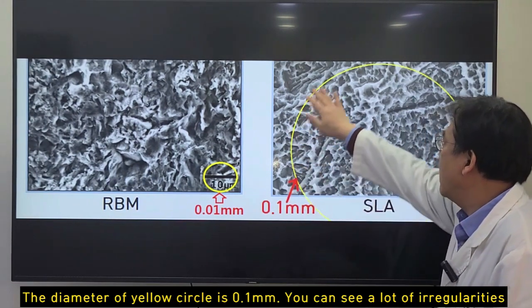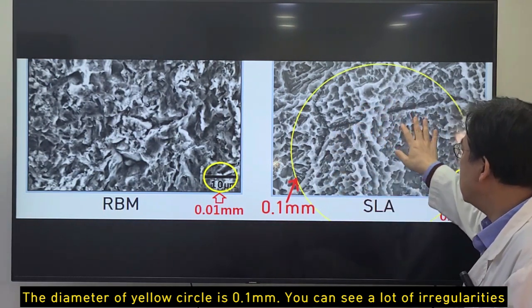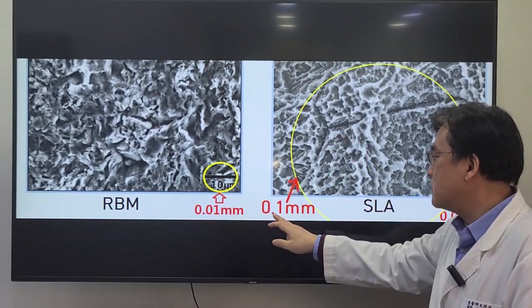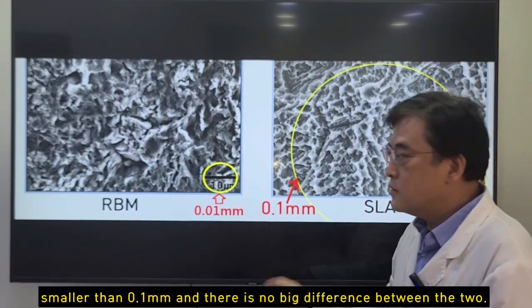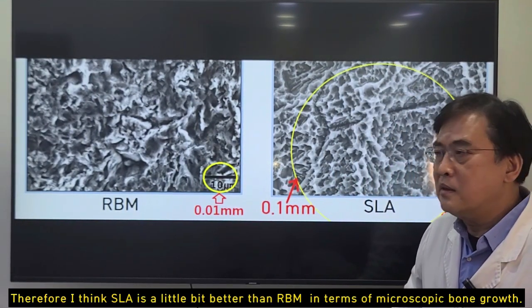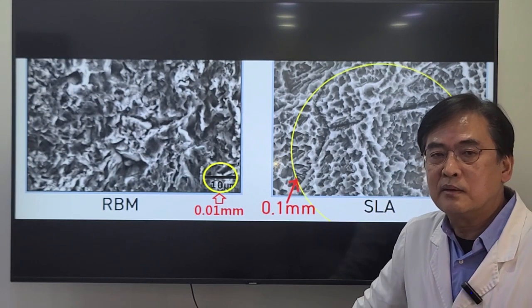The diameter of the yellow circle is 0.1 mm. You can see a lot of irregularities coming into the circle, which means the size of the irregularity is still smaller than 0.1 mm. And there is no big difference between the two. Therefore, I think SLA is a little bit better than RBM in terms of microscopic bone growth.